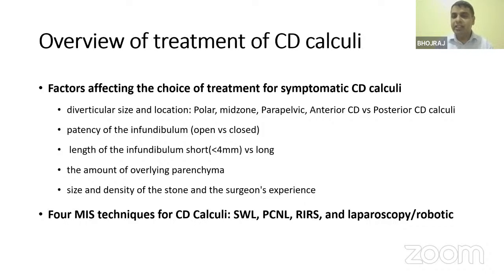Being in the era of minimally invasive surgical techniques for stone management, shockwave lithotripsy, PCNL, RIRS, laparoscopy, and robotic, these are the techniques that we opt for management of the calyceal diverticular calculi.